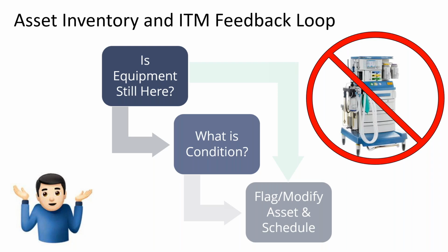So, did I find it? Yes. If it's yes, that's easy. It's probably most of your equipment. You're probably finding most. It's that last 5 or 10% that cause you the most hassle. If it's there, you PM it. If it passes, put a sticker on it for the next month, or however you mark when the next one's due. Training the staff on what sticker to use, if there's a different color each year, and how to pull the asset inventory report for their cost center, et cetera.